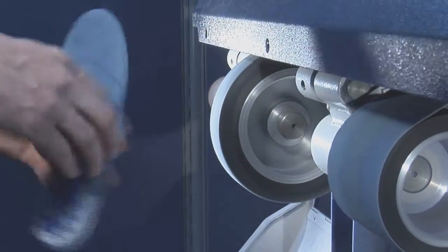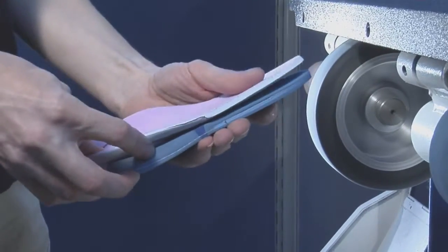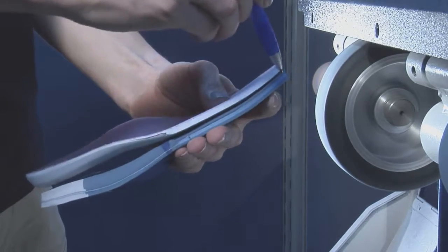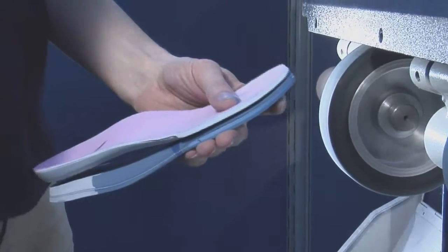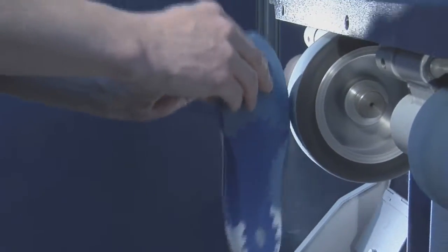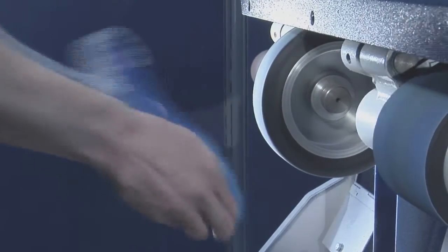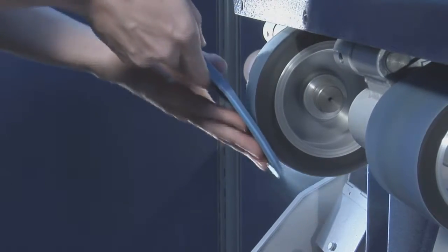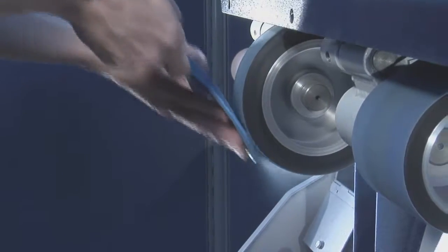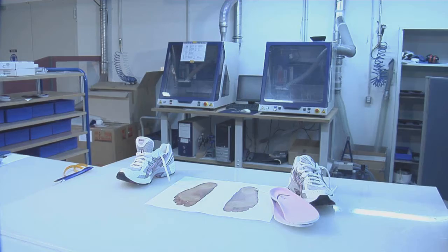The front shape of the TRIactive is guided by the shoe's inner shape too. For a perfect fitting, just copy the shape of the prefab inlay to the bottom side of the insert. We recommend modifying the front part also in a slightly tapered shape. As described earlier, the material thickness below the toe area gets thinned during the later grinding process. Especially during sports activities, the toes need enough space without limitations.